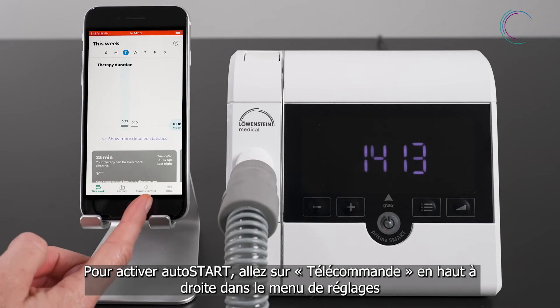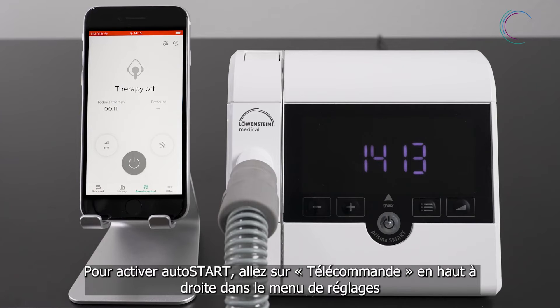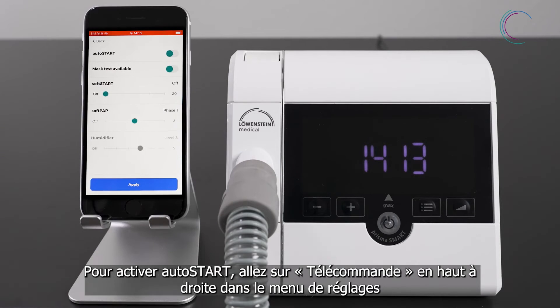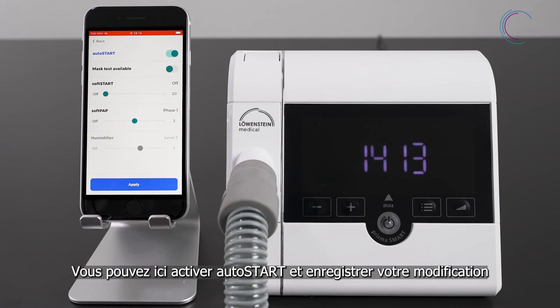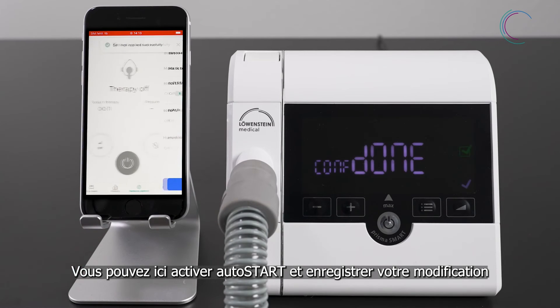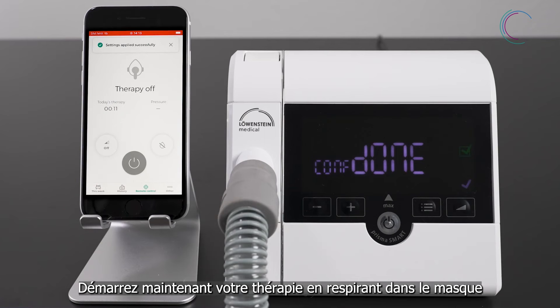Go to remote control and then to the setting menu in the upper right. Here you can activate AutoStart. Apply your changes. Now you can start your therapy simply by exhaling into your mask.